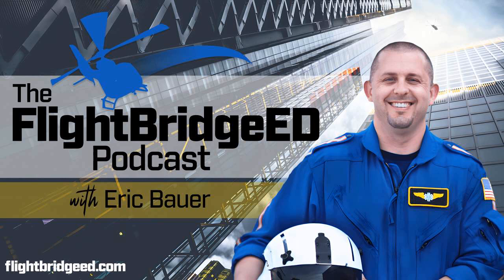Well, think about our I time. And for purposes of this, we're not going to dissect I time as it relates to volume delivery or pressure delivery. We're just going to lump it all up into one big category, and we're just going to discuss inspiratory time versus expiratory time. And we can hit on those differences in a later podcast. So our inspiratory time, think about that as recruiting alveoli. If we deliver an inspiratory time that's longer, we're recruiting alveoli longer. And so we would lengthen our inspiratory time in patients that may have a hypoxic issue.